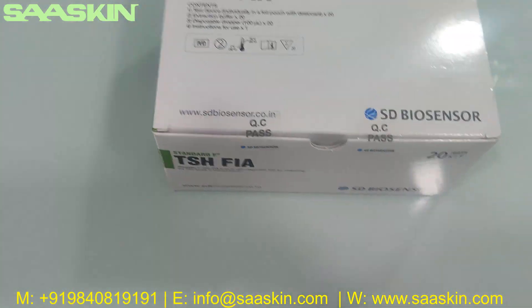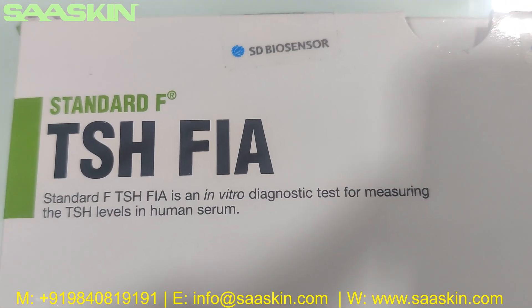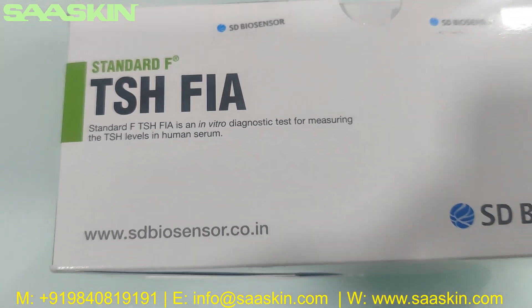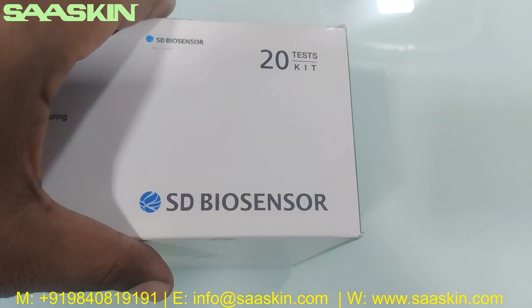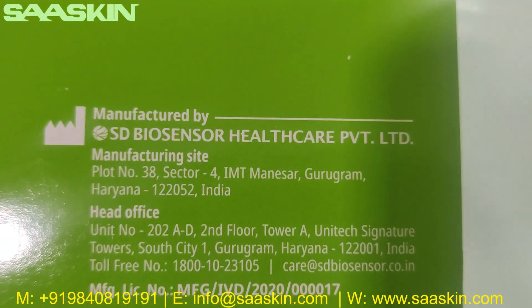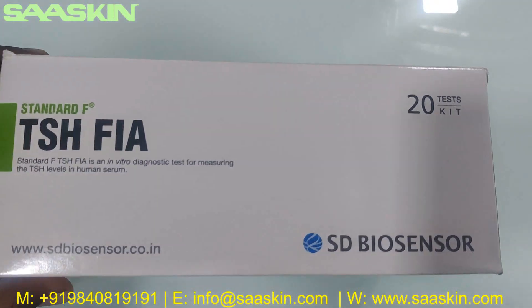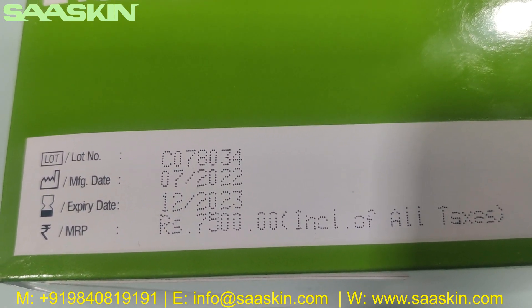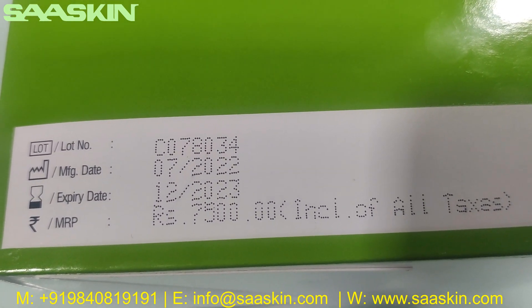You also get one IFU brochure. Let me go around this box for you. STANDARD-F TSH FIAT is an in vitro diagnostic test for measuring TSH levels in human serum, using a fluorescent immunology method. This 20 test kit pack is manufactured in India. On the sides of the box you can see the lot numbers, manufacturing date, and expiry date — on standard it has roughly 18 months of expiry.